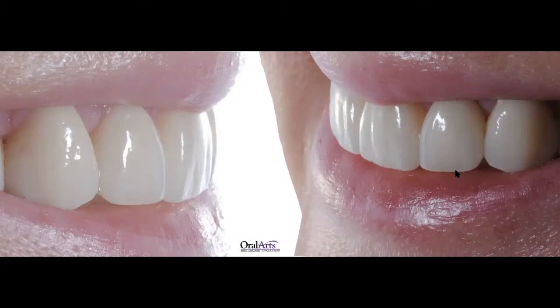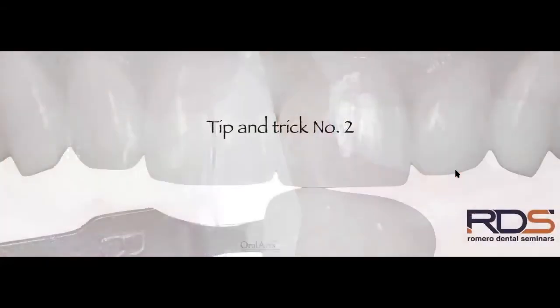But lithium disilicate is still a strong material, and it's a beautiful material because of its natural capacity of transmitting light, which is what at the end of the day we as restorative dentists are looking for when we have these single restoration teeth. And I'll show you a case shortly, what that means and how difficult this can be. And this is the one that I'm going to share with you in my tip and trick number 2.